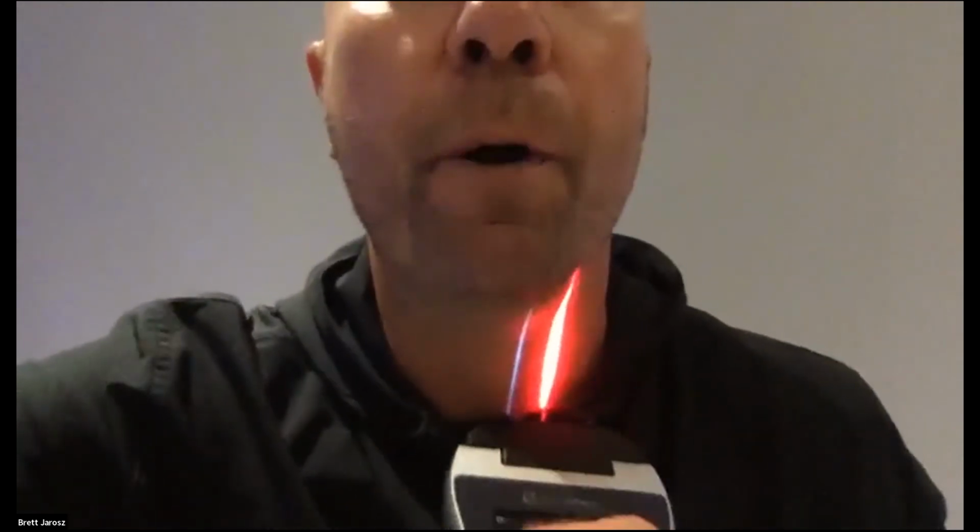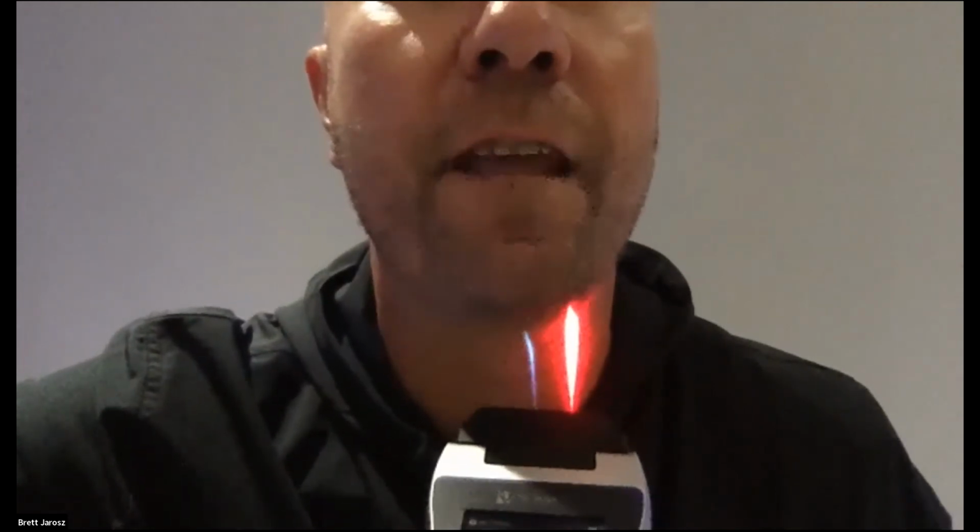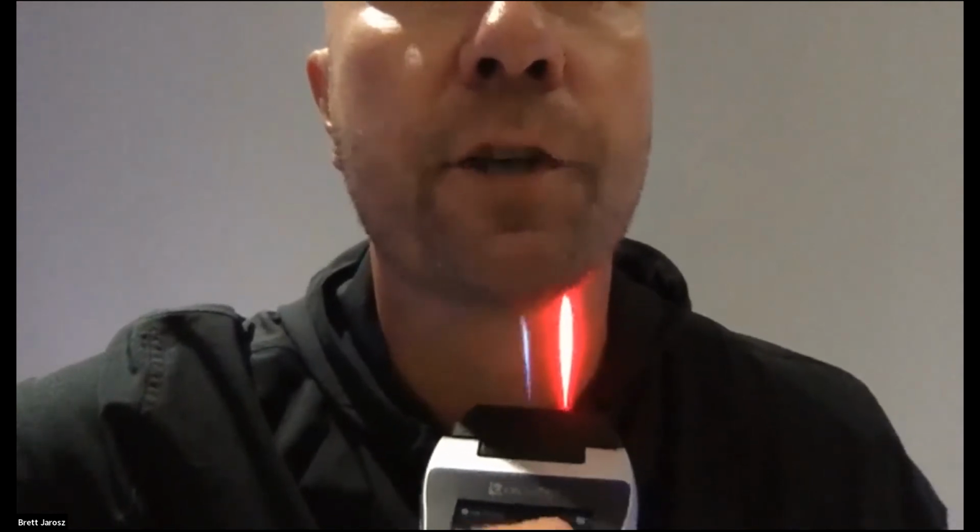After the 2 minutes, I then come to the spinal cord. So I'm swimming upstream. Now, obviously, I'm not going to be able to demo this very well from the back. So let's just say you're looking at the back of my spine here. We would put the violet directly over the spinal cord in the midline, and then the red goes over the nerve root. So if I'm talking about shoulder, as it relates to the musculoskeletal tissues, we're in that C5 area. So when you put this laser over the nerve roots, you want to be covering that C5 area of the spinal cord nerve roots. So we would then do that for 2 minutes on the appropriate side.